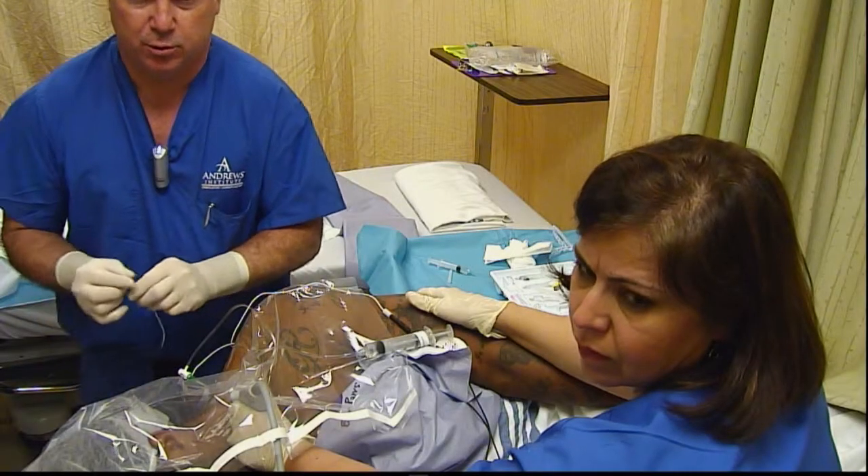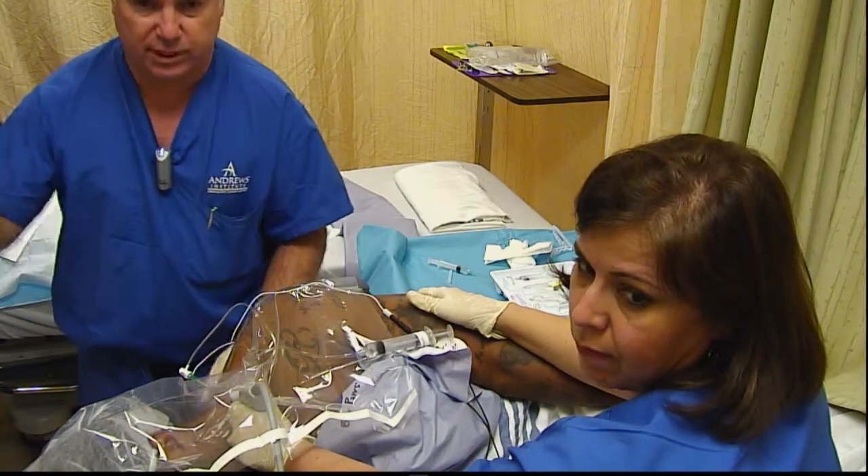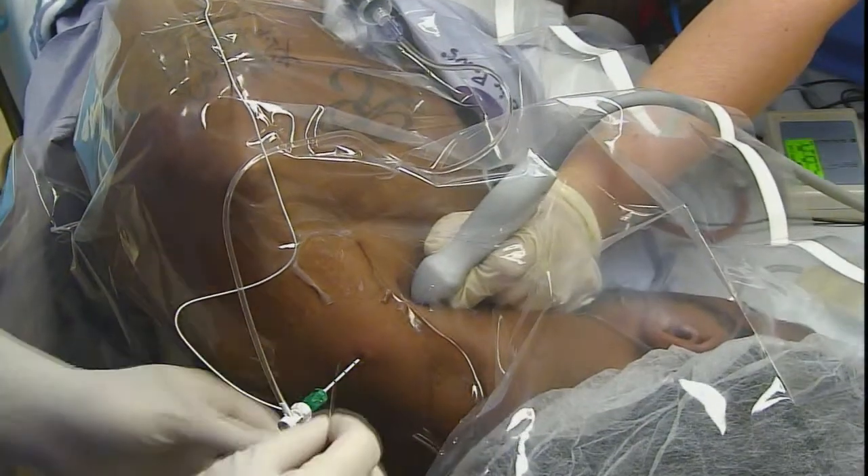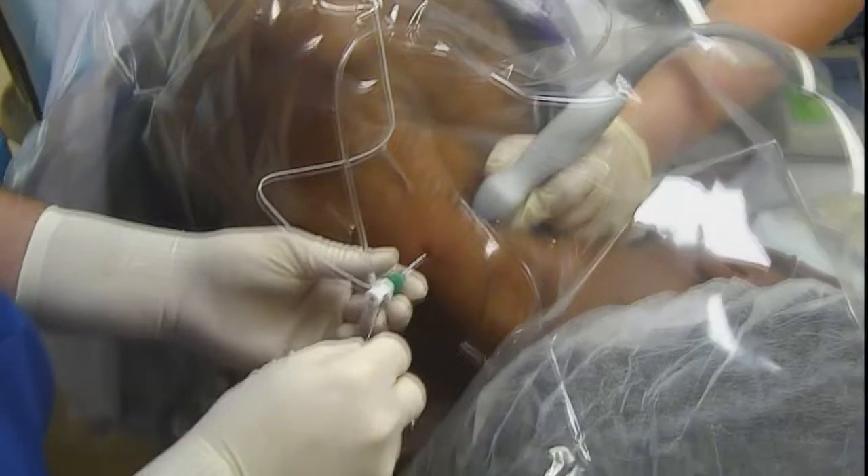Now what that's done is opened up our space where we'll have room to put our catheter in, and it'll end up in that same space between the plexus sheath and the middle scalene muscle.